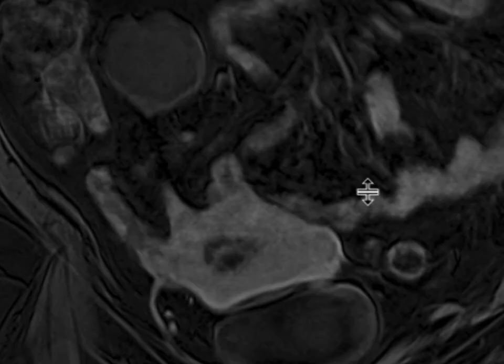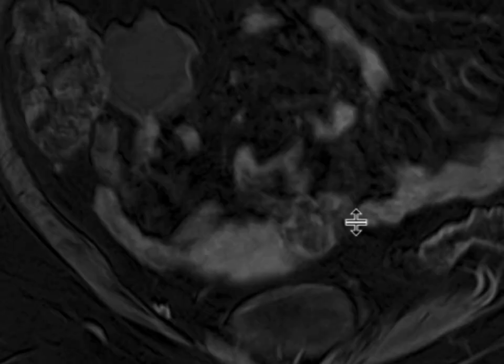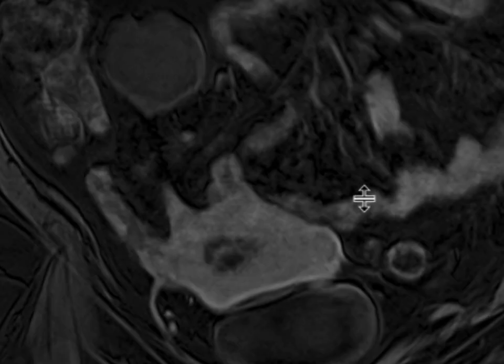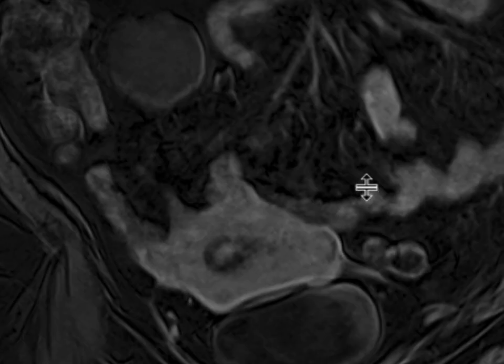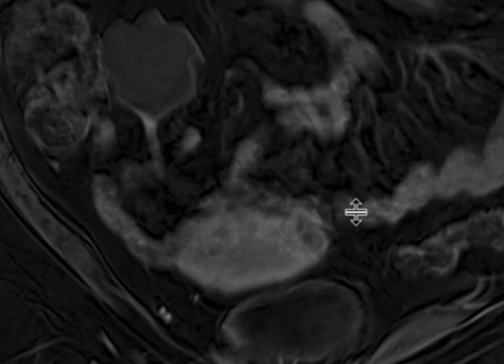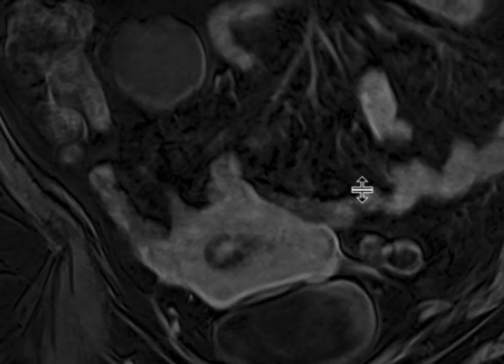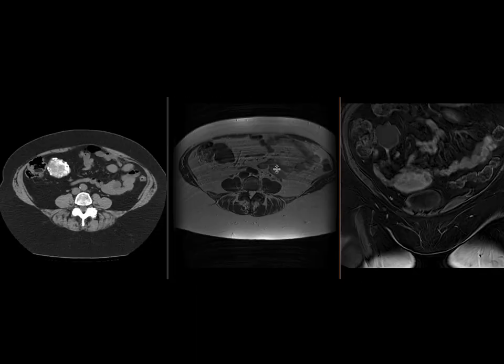The additional mass also turns out to be a subserosal fibroid — specifically a pedunculated fibroid with a rather long and thin stalk, which terminates in this calcified fibroid in the right lower quadrant.